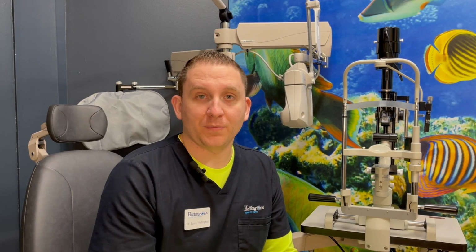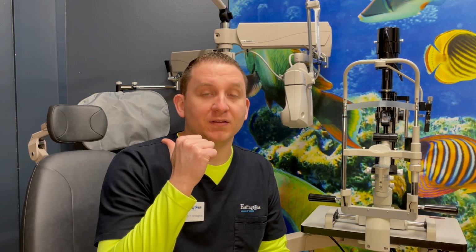In this video, we're going to be talking about fundus photography and what it looks like to have a picture taken in the back of your eyes. So, what is color fundus photography? A lot of times we use color fundus photography, fundus referring to the back of the eye, known as your retina, because in the human body there are actually a couple of different fundus locations, but for the purpose of this video, we're going to be talking about the retina in the back of the eyeball.